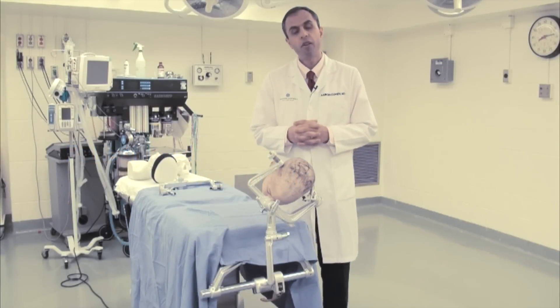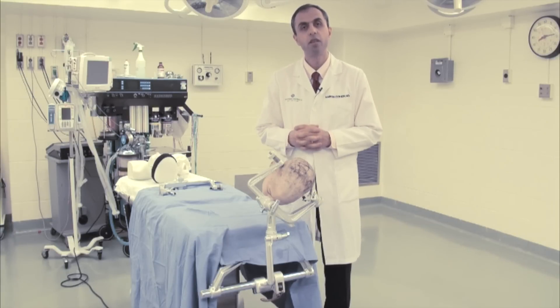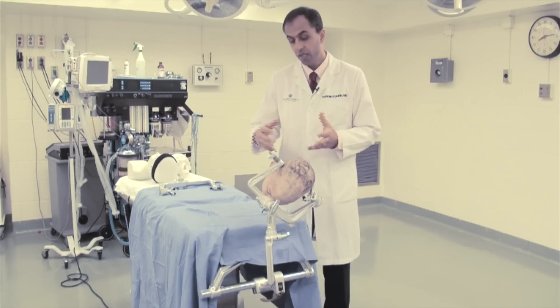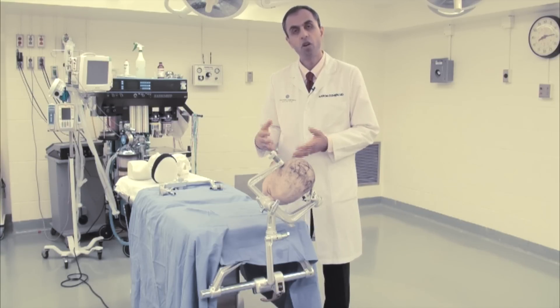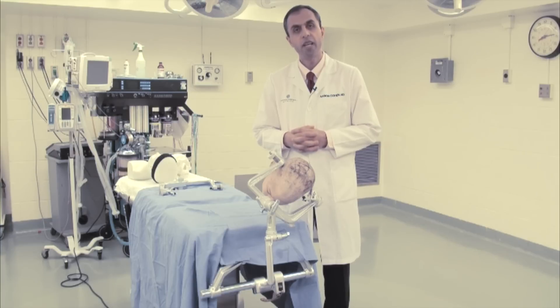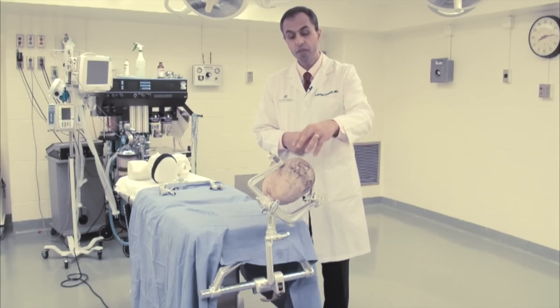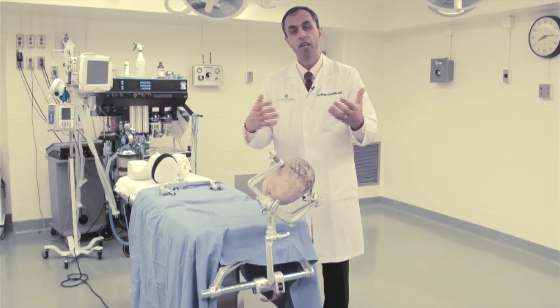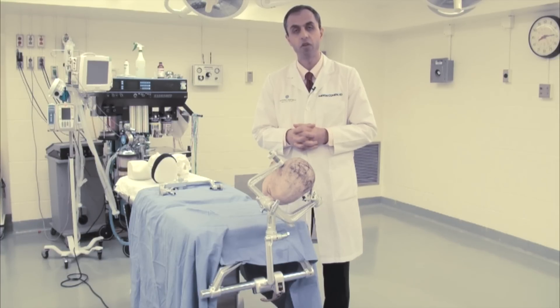For the parietal craniotomy, we also place the patient in lateral position. This places the neck along the long axis of the spine in a more physiologic position, preventing more aggressive turning. It also most commonly places the area of the surgical field along the highest point, and we can use gravity to drain some of the blood out of our surgical field.